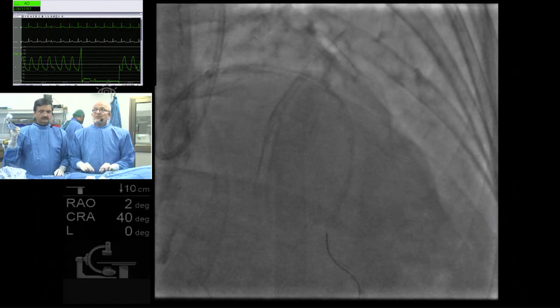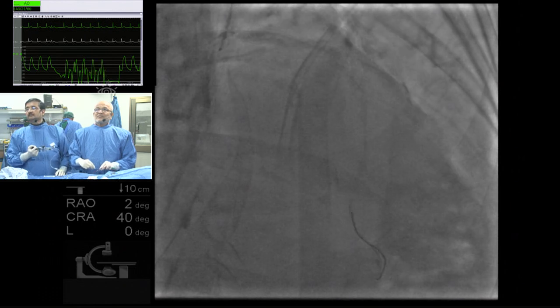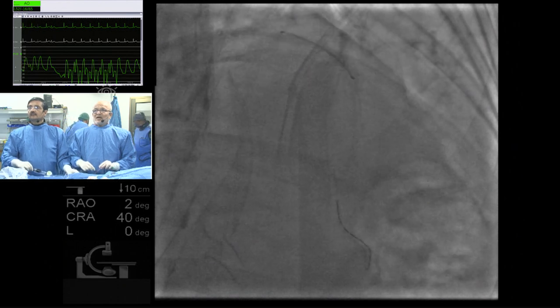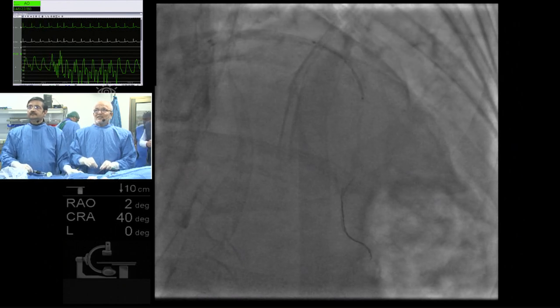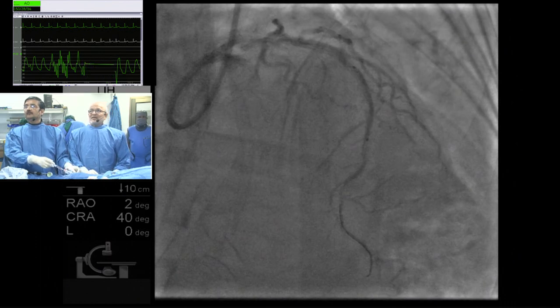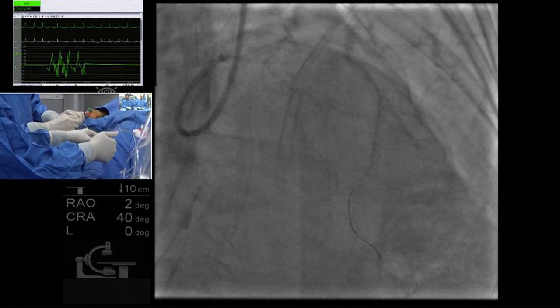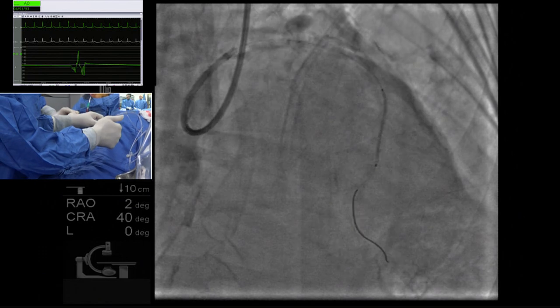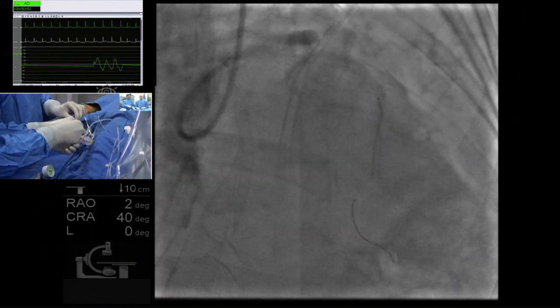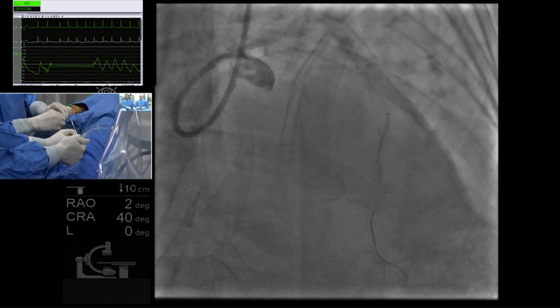It's not laser cut. These are welded crowns, and then the welding goes spiral. So it has a very good radial force, and it navigates here very nicely. Because I'm struggling here. Did you feel like you were getting stuck, Tejas? Inject. A little. Yeah, that shows the properties of the stent because it's rounded metal, so that's why it doesn't get stuck like a laser cut slotted tube.